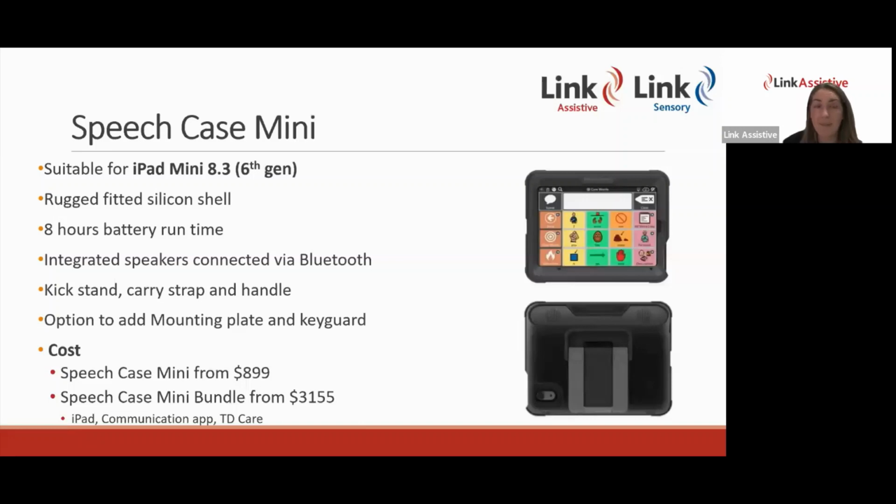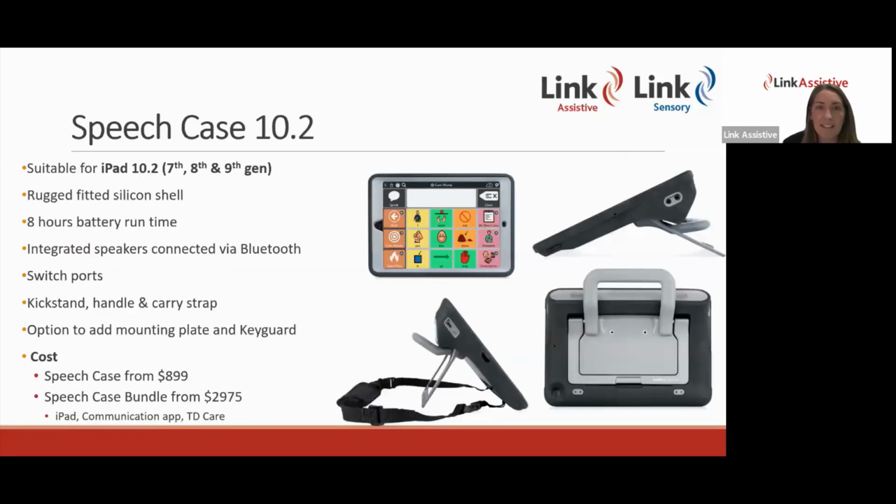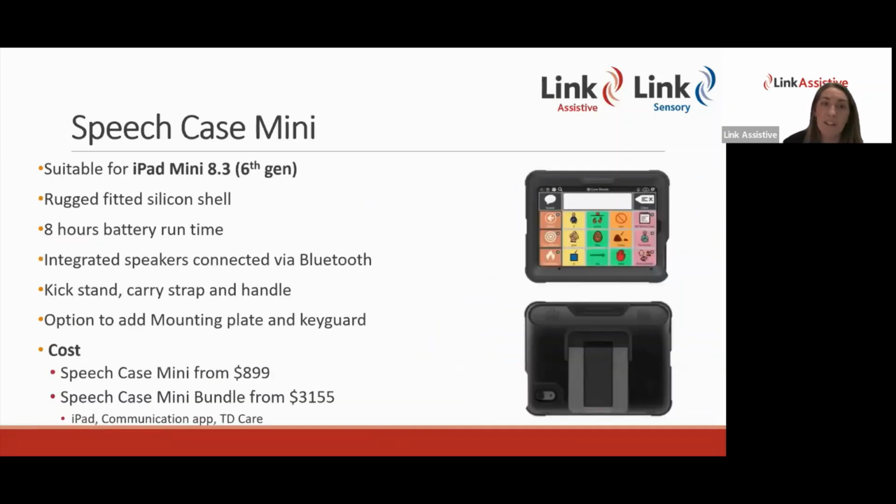What the speech case mini doesn't have that the speech case 10.2 has is switch ports. So in the side of the device, you can connect switches on the iPad speech case 10.2, but on the mini, there's no switch ports, but if you did want to use a switch with it, you could use a Bluetooth switch.